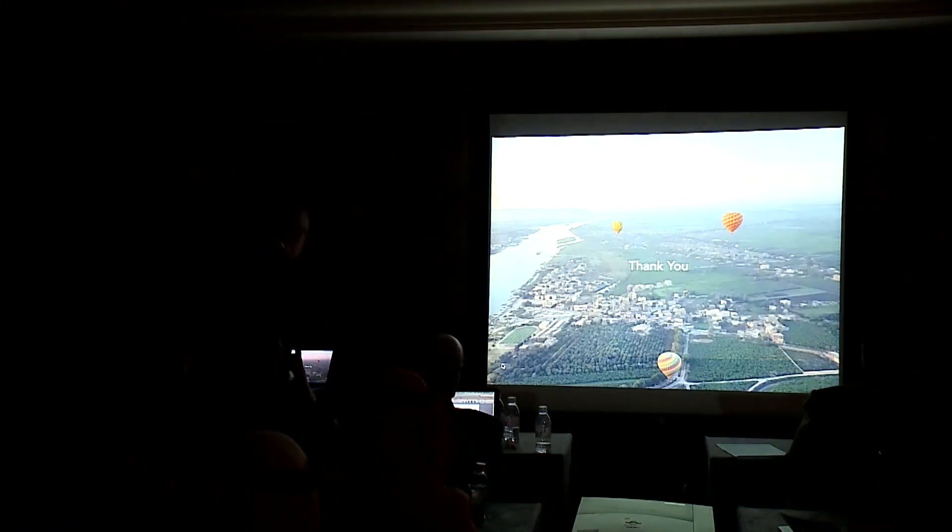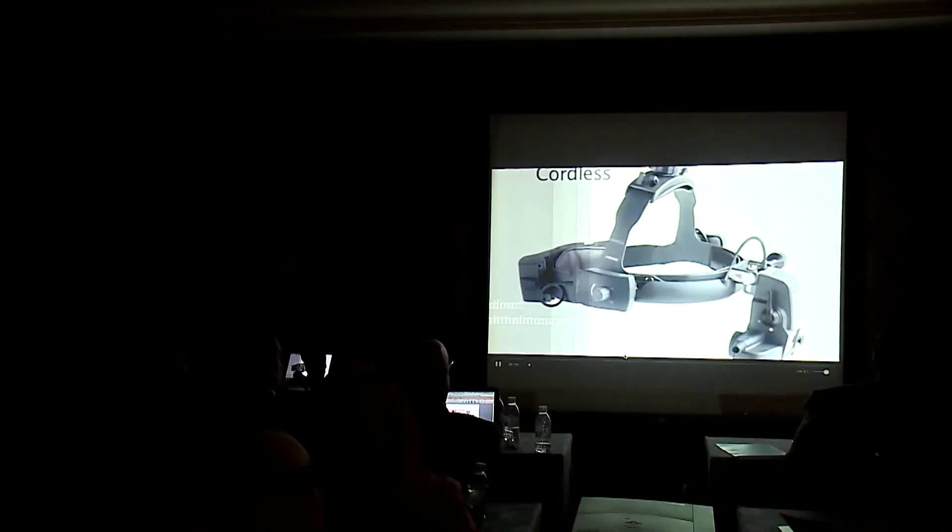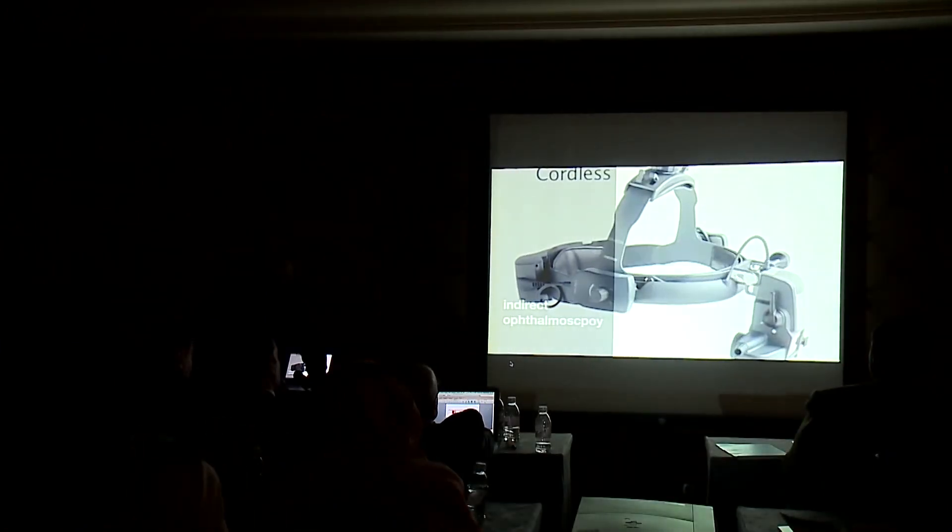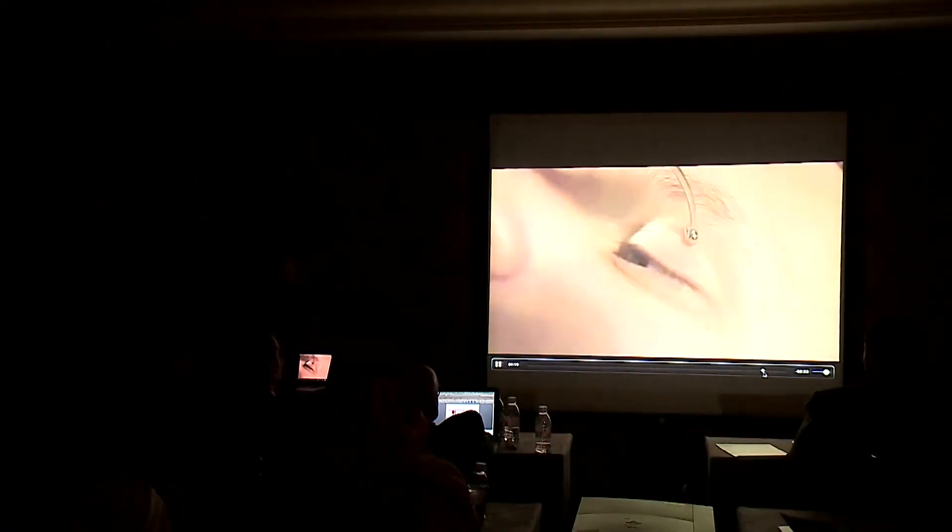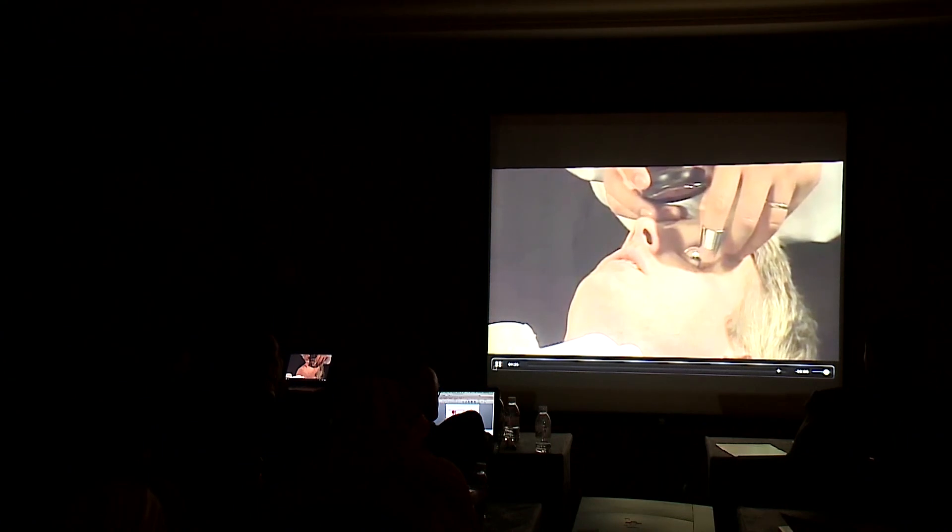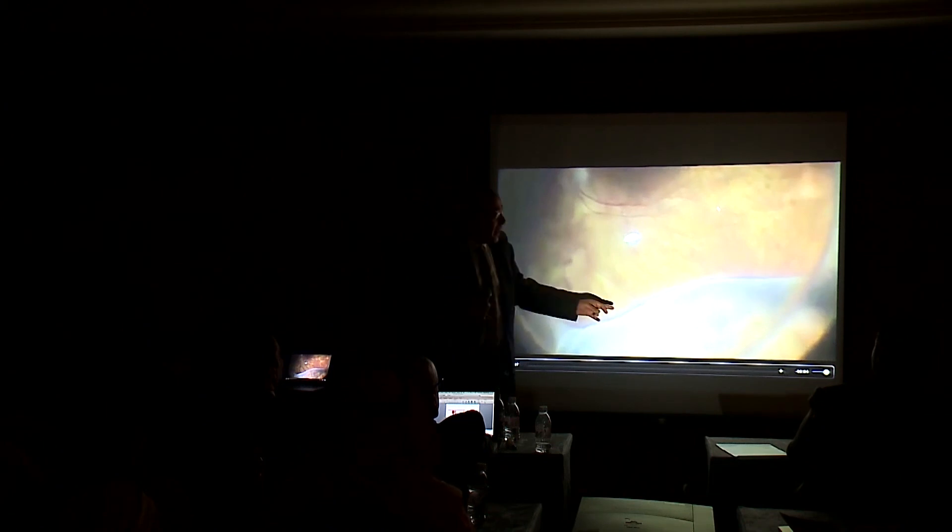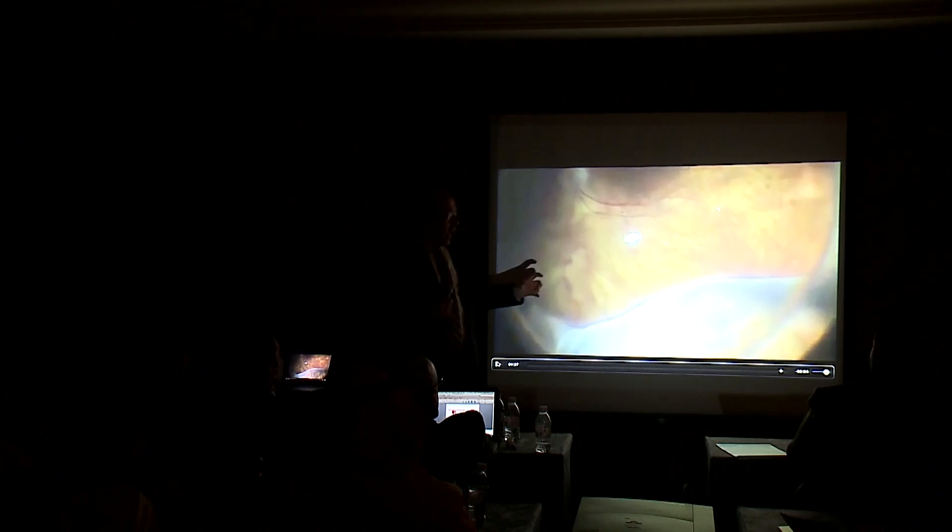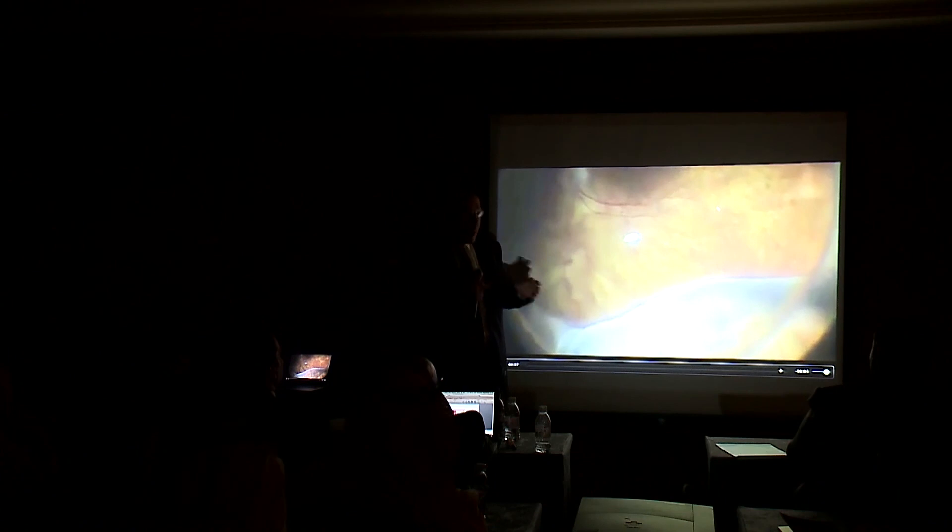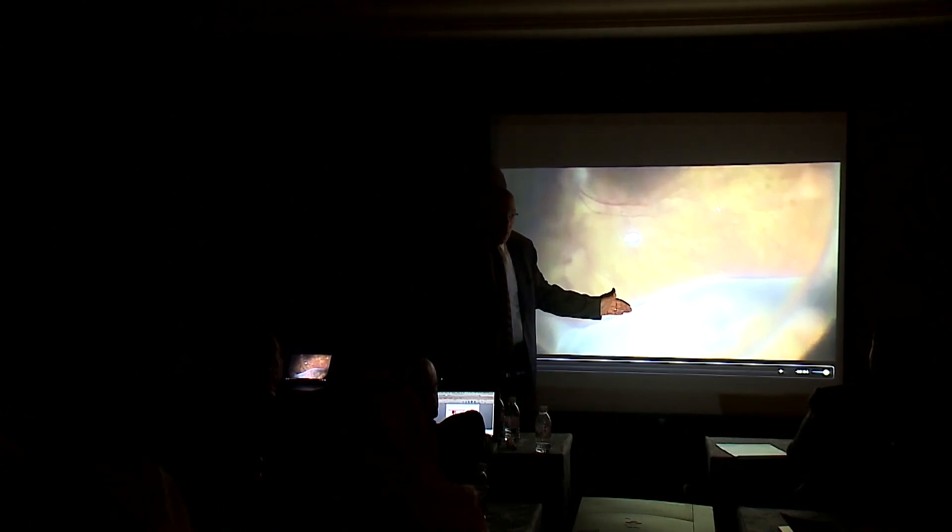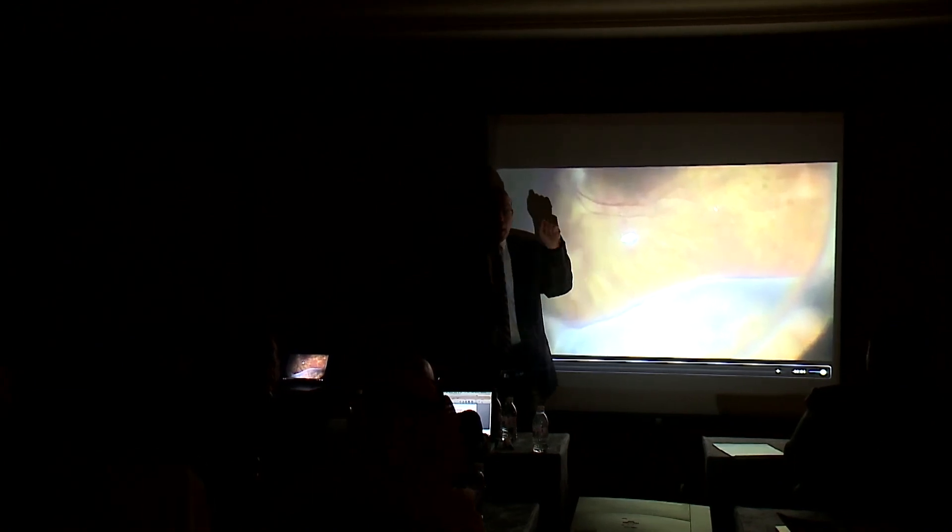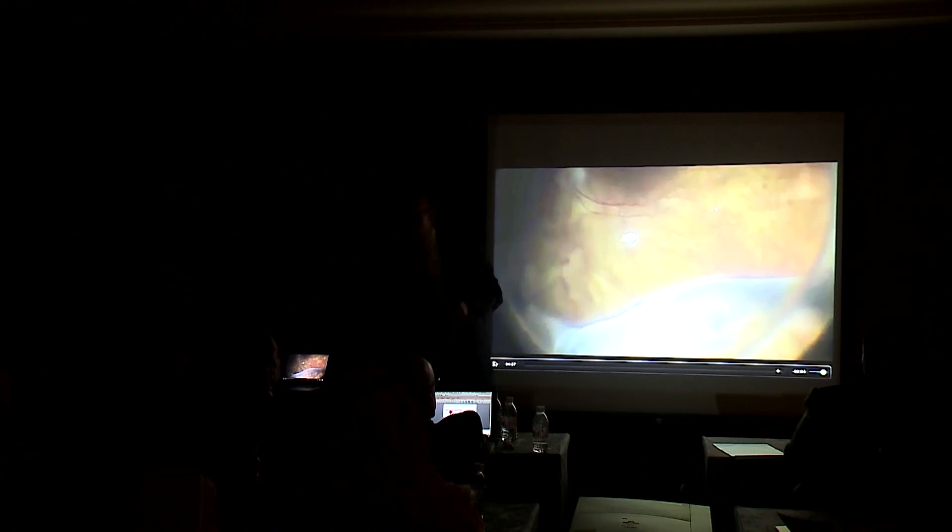The depressor needs to be in the right hand. Very important for you who are going to go to the OR to treat retinal detachment. This is the picture during scleral depression, and again what appears closer to the lens, to you, is peripheral. And that's what you should concentrate on to find the location of retinal breaks because before surgery you had located the break, but during surgery you have to confirm that during your scleral depression.